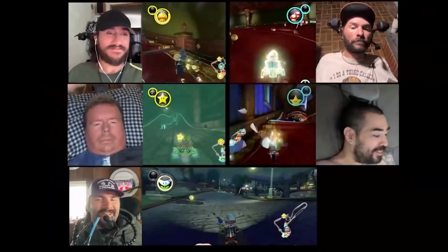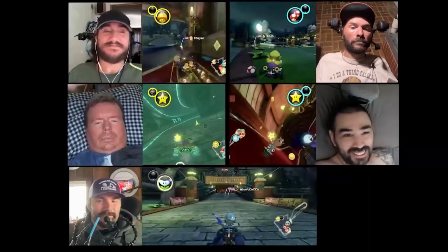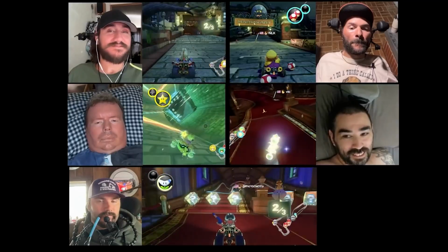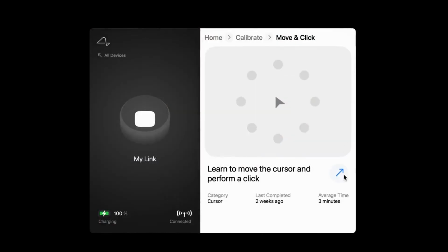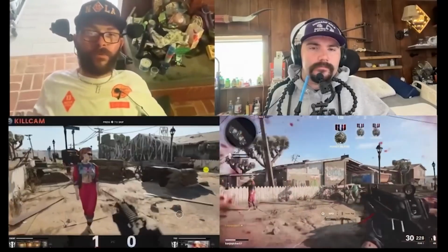And if someone wants to ask, but I play WebGrid faster than paralyzed Noland, first, I said he's not faster than everyone, only some, and second, this is just the beginning. Neuralink's team noticed something interesting. Noland could move the cursor without thinking about moving his hand. He literally just thought about the cursor moving, and it worked. So we've understood how Neuralink works, how signal transmission happens, and even a bit of how the brain works.